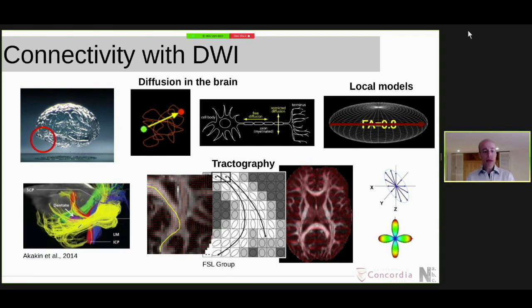Okay, we then take all of that, you do this probabilistic mapping, and then you map, for example, from the pons through to the cerebellar cortex. So here you can see the tractography from the pons directly through the cerebellar cortex and coming up from the ICP here in red and then out from the SCP in green in this particular example. So this is what it would look like with a simple tractography analysis within the cerebellum.